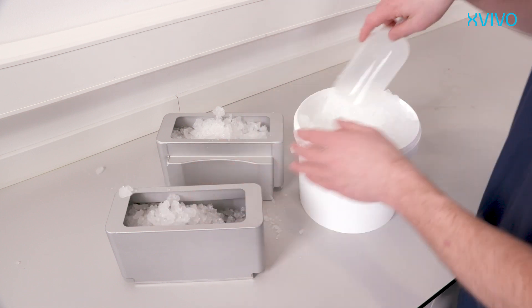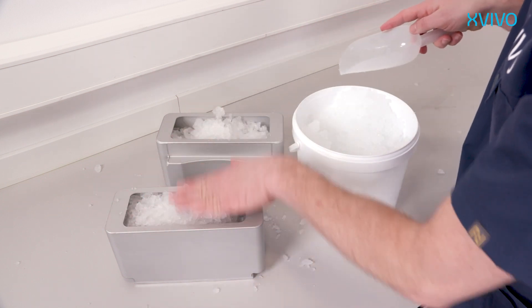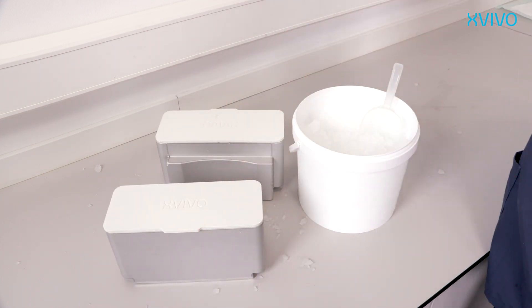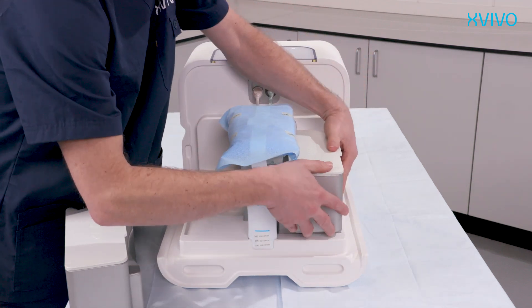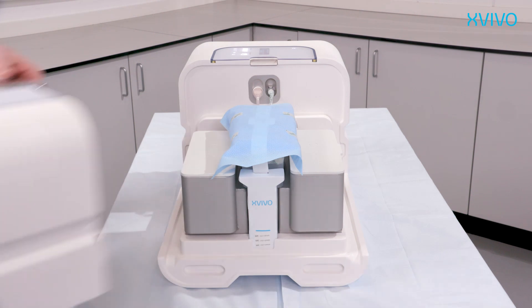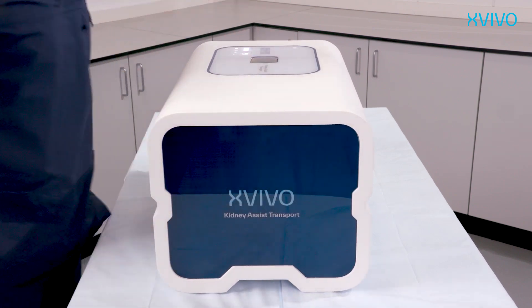Fill both ice reservoirs entirely with crushed ice. Make sure to press the ice thoroughly into the reservoir to ensure maximum ice volume is filled. Close both reservoirs with their corresponding lid. Place the ice reservoirs next to the perfusion reservoir in which the kidney will be placed to ensure sufficient cooling. Close the perfusion compartment with the device cover to keep the interior cold. When the system is sufficiently cooled, it will automatically proceed to the next step.